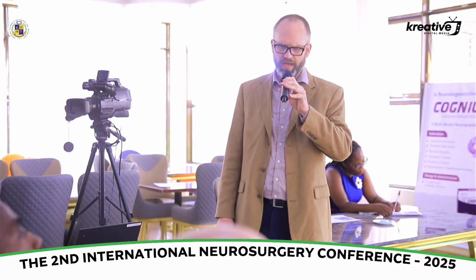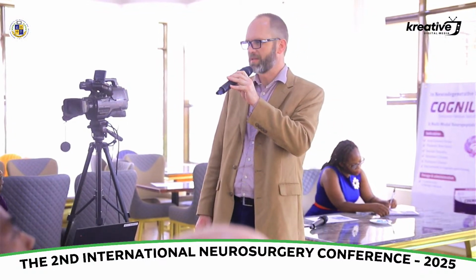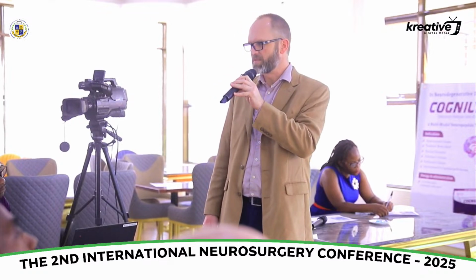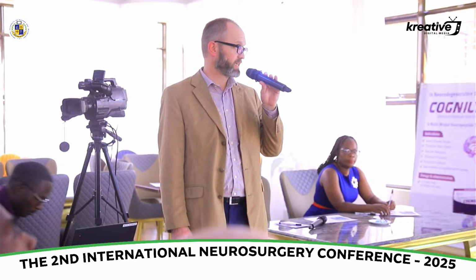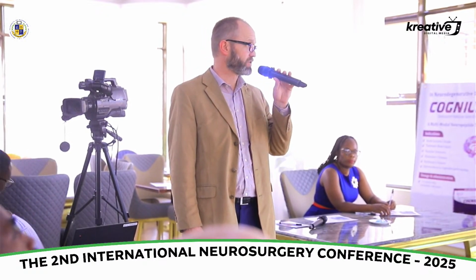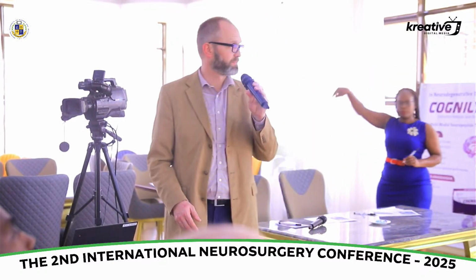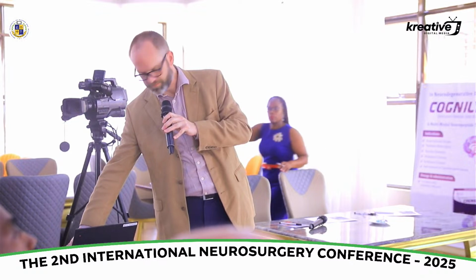B-mode ultrasound, as it was developed, is really what led to a lot more utility in other realms of medicine, including neurosurgery. It's called brightness modulation, and this is a two-dimensional image of the underlying tissue. And again, the brighter the image, the stronger the echo.